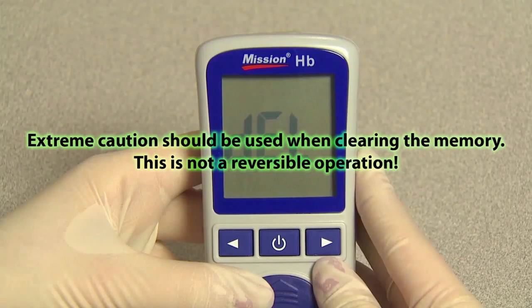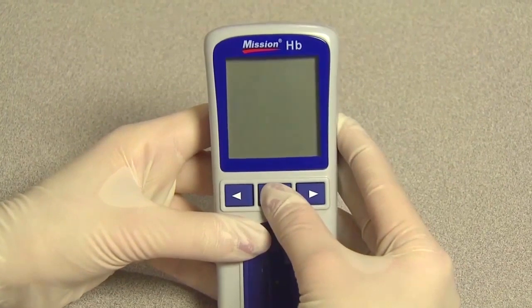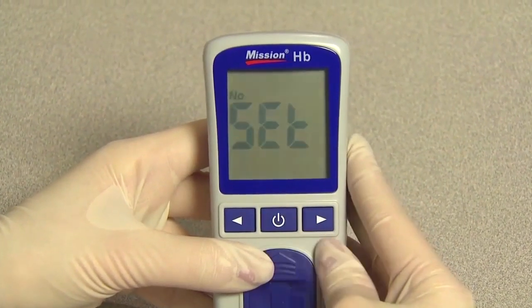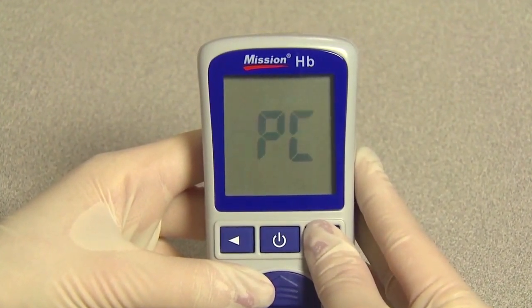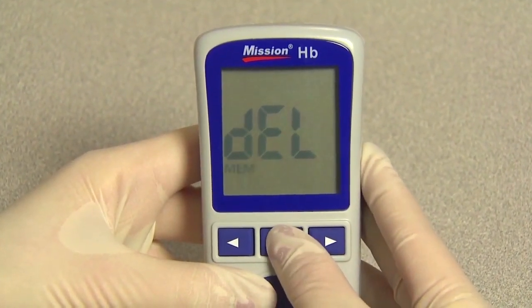Extreme caution should be used when clearing the memory. This is not a reversible operation. To delete all data from the meter database, press and hold the power button to enter the setup menu. Press right or left until DEL is displayed. Press the power button to enable data deletion.